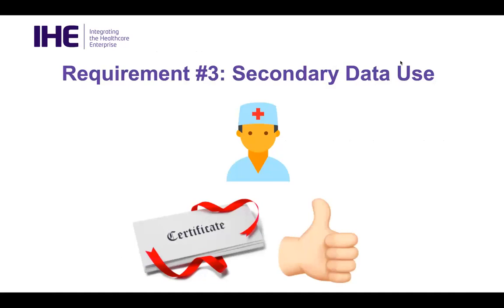Privileging at my hospital requires me to send information on how many times I've performed an exam and the outcomes of my exam, as I've talked about. And the ED providers and the surgeons and others want to have the metadata from the procedures that they're capturing easily available so that they can say, I've done 200 abdominal ultrasounds. My privileging should go through more quickly than somebody who's only done 5, or somebody who can't prove that they've done any.